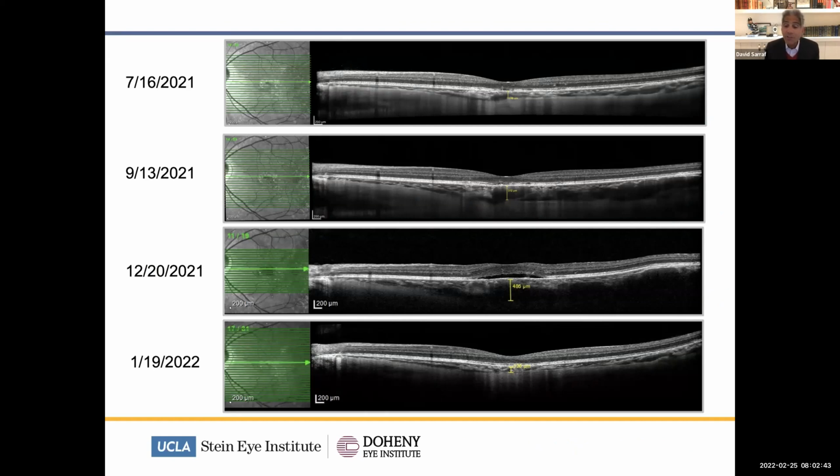This is a recent case that I've been working on actually with the fellows. I'm very excited to show it. I just added this case last night. It's a patient we saw just this week, actually, in whom we see these remarkable increases in the choroid associated with anterior uveitis that was thought to be related to the patient's herpetic infection of the cornea.